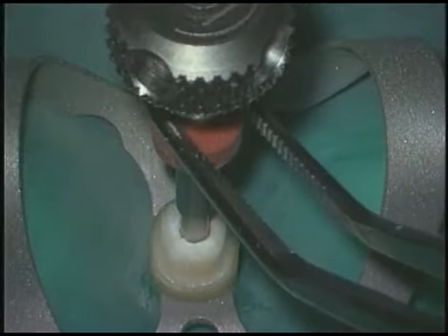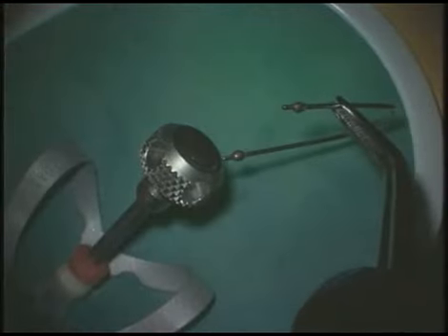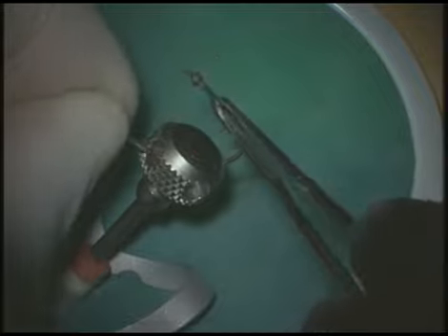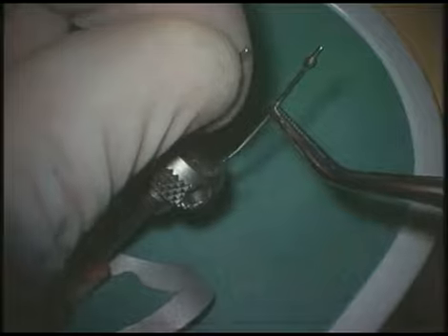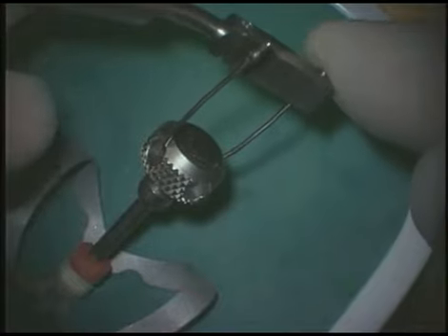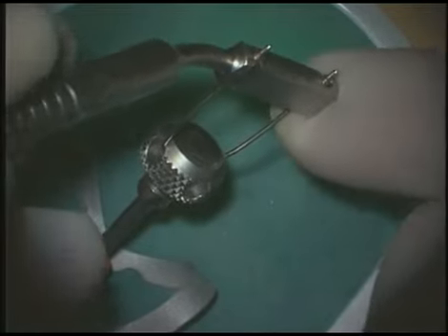Once it's tight, the rubber cushion is placed down over the top of the tooth if we were to use the extracting plier, but in this instance, the Cavo Coronaflex is going to be utilized. The stirrup is slightly modified at its horseshoe end so that it can rotate through the cutouts of the handle. With the stirrup in place, we can now mount the soldered joints into the mounting bar, and once this is mounted securely, then we're going to select the cable Coronaflex.